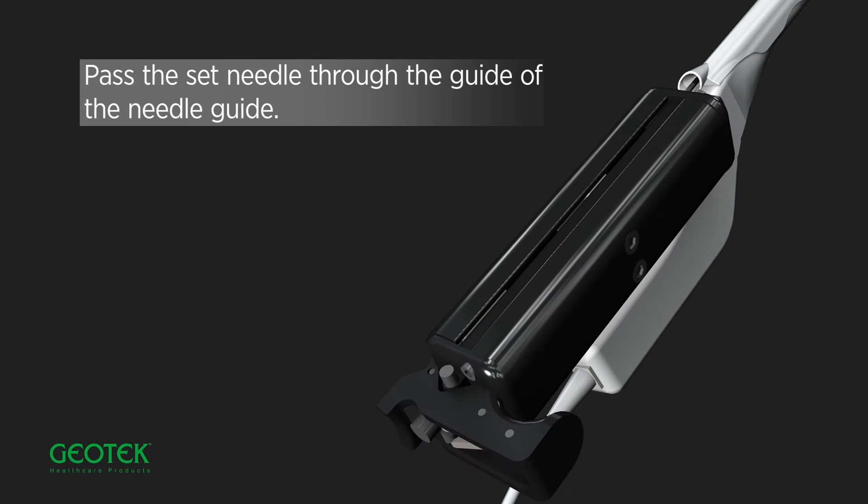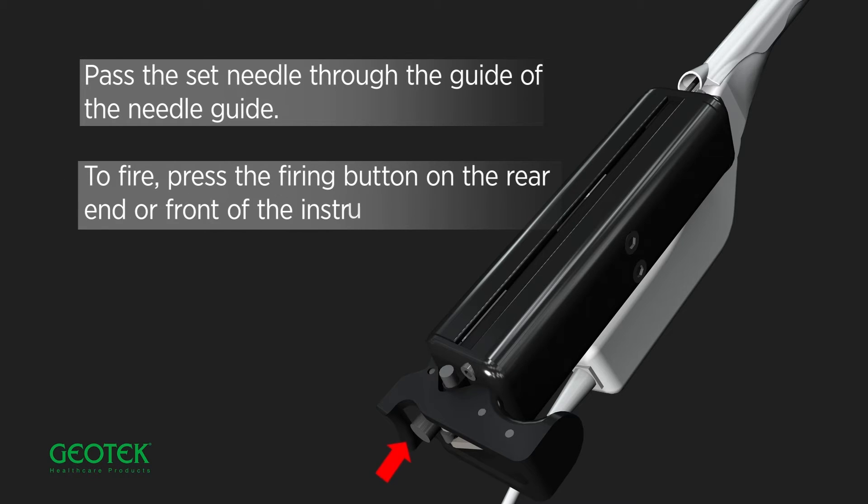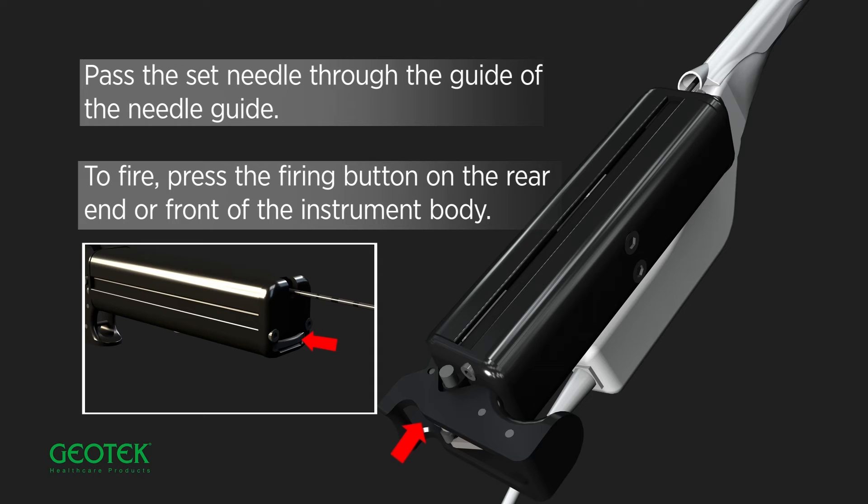Pass the set needle through the guide of the needle guide. To fire, press the firing button on the rear end or front of the instrument body.